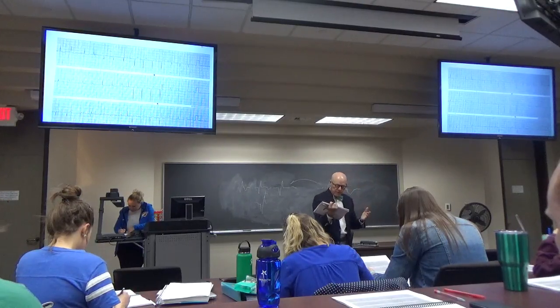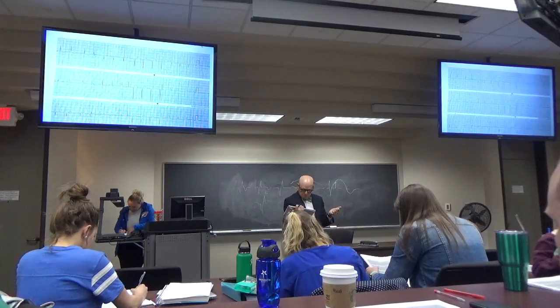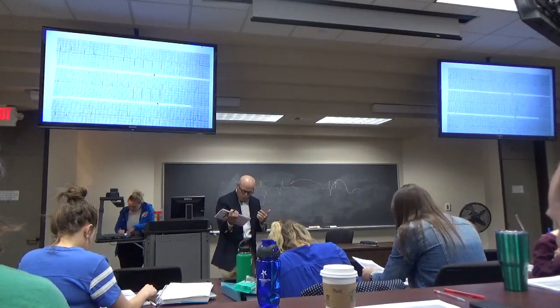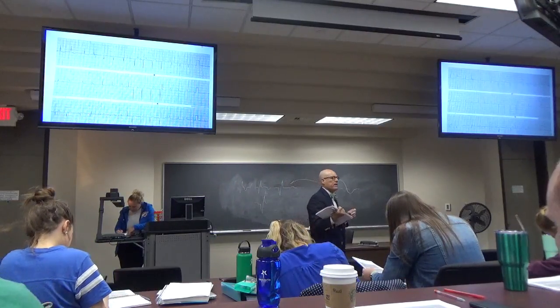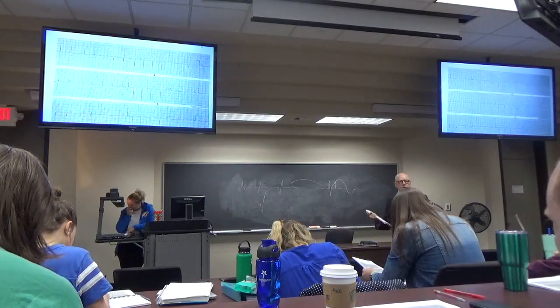Anterior infarction and an inferior infarction and the ages. I think the anteroseptal infarct is old. The inferior infarct might be new. The ST segment's a little bit elevated. The T waves are upright. I don't really know what the age is, but I would accept anything you said on that one, yeah.